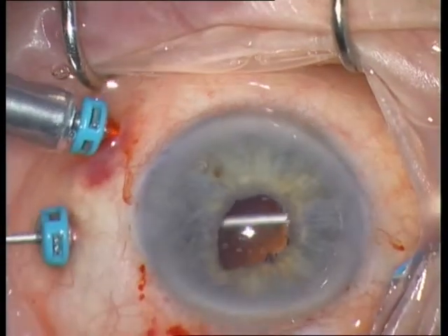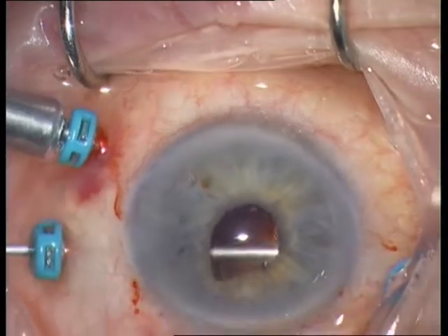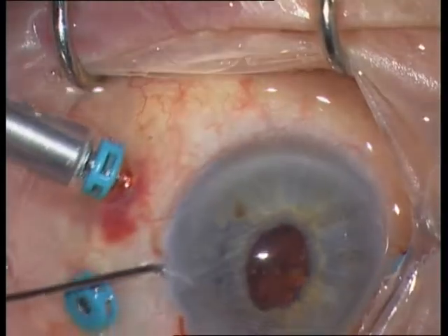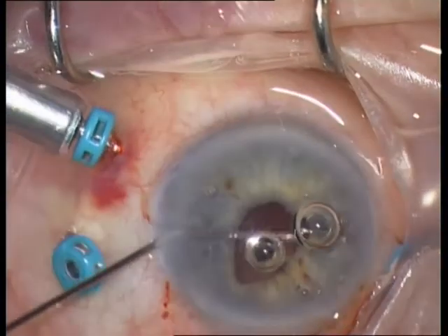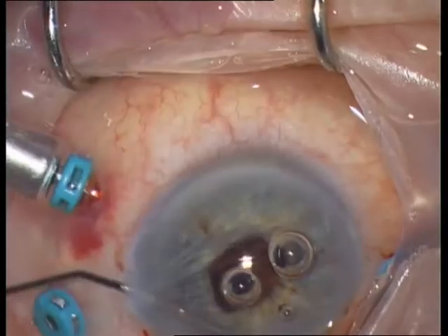I continue with an anterior vitrectomy. The tip should be visible during vitrectomy — if you go along the edge of the pupil, you are on the safe side. Then inject acetylcholine into the anterior chamber in order to constrict the pupil.